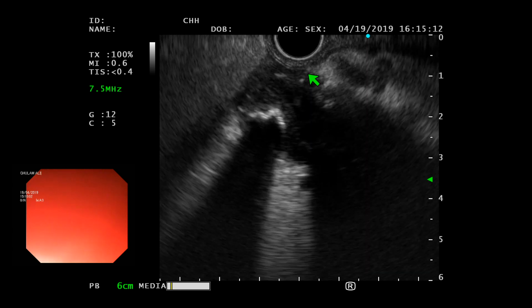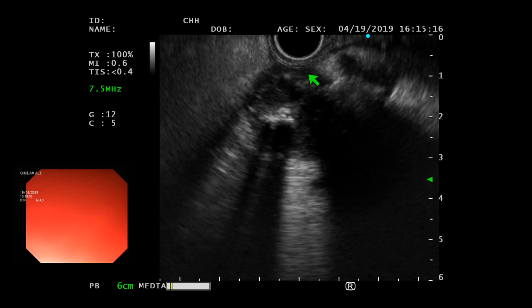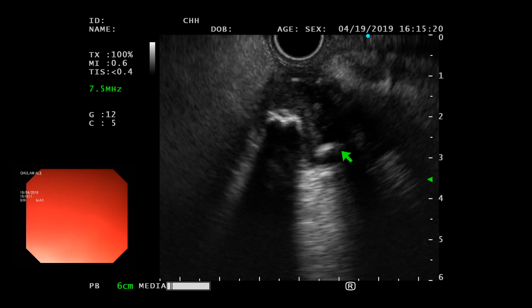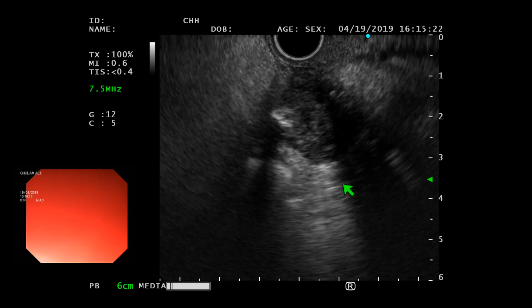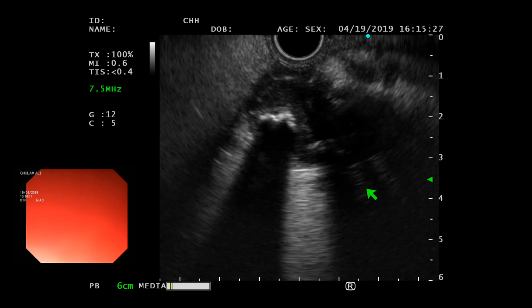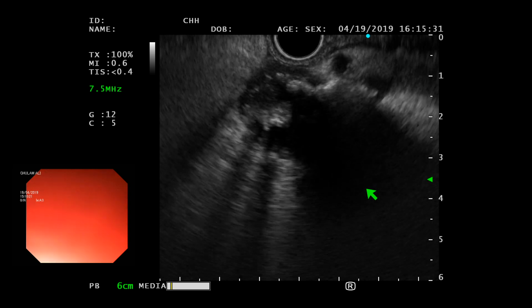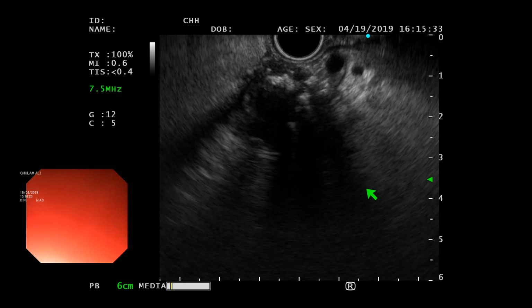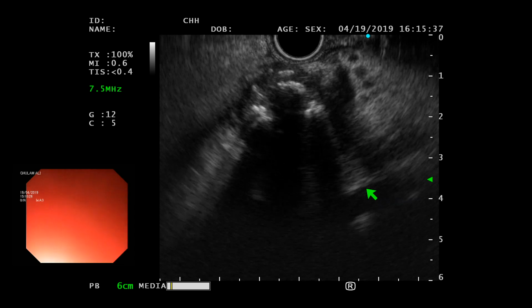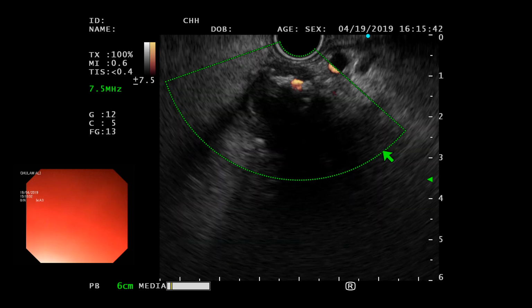And there's so much calcification that you have no idea, and I have no idea what's underneath there. It's all shadowing there, so we don't really know what's happening over there, and there's no way to find that out. Cross-sectional imaging, yes, that might tell you, but with this one we cannot tell. There are so many vessels, collaterals here actually. There are collaterals all around there. Okay.